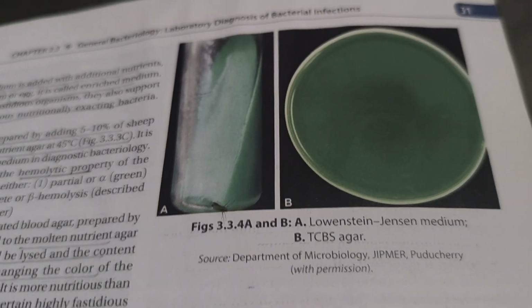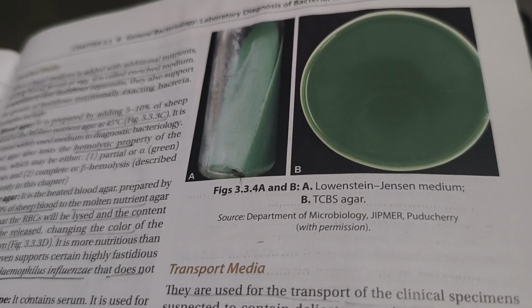Figure A is LJ media and figure B is TCBS agar.